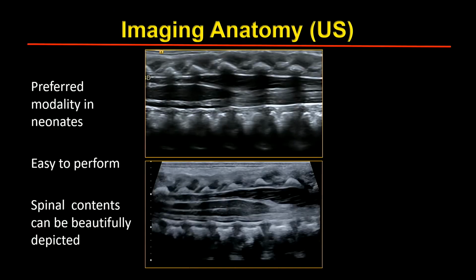Now, ultrasound is very easy to perform in neonates because the posterior arch of the vertebrae is not yet ossified. So it provides a perfect acoustic window. The sonographic examination usually is performed in a warm room, with the patient usually lying in a prone position. One can obtain imaging in left lateral decubitus positioning. Now, feeding the infant and placing a warm blanket creates magic. The examination is very, very easy, such a simple step. Similarly, just placing a towel underneath the pelvis flexes the pelvis and opens those unossified arches more to allow better visualization. So these are some steps that can make the exam very easy to perform.